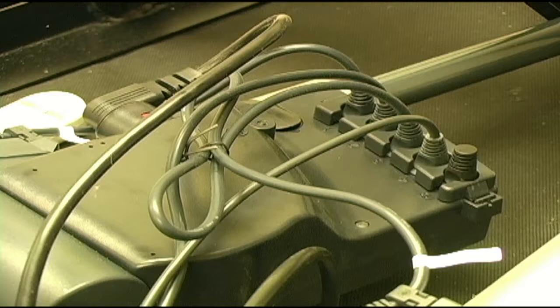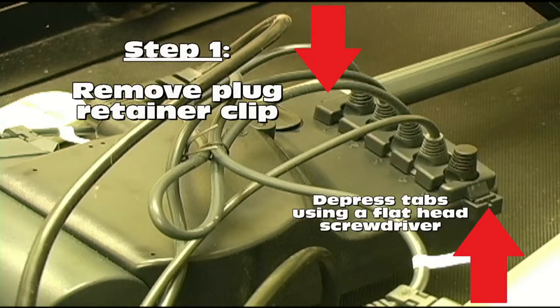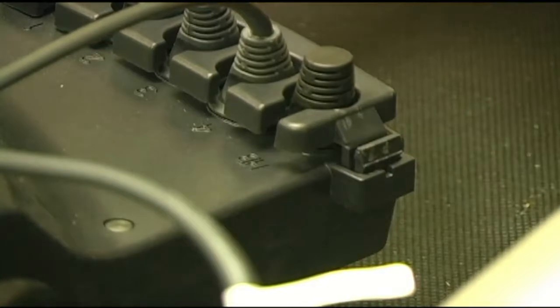Now let's begin and show you how to remove your control box. First, we need to remove the plug retainer clip from the control box so that all wires can be unplugged. The plug retainer clip can be removed by depressing the small tab at each end of the clip with a flathead screwdriver. The two tabs that hold the plug retention clip in place are seen here.